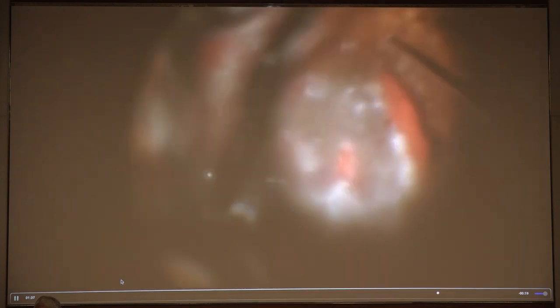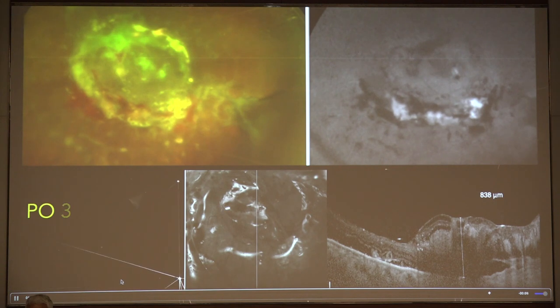So the peripheral retina, what was left untreated, it was redundant. So I used a Finesse flex loop and mobilized this flap underneath the PFCL and kept it over the macular hole. That was the idea of doing a modified autologous retinal graft, because the peripheral retina is not useful for any kind of purpose. So this kind of situation may happen in your surgery.